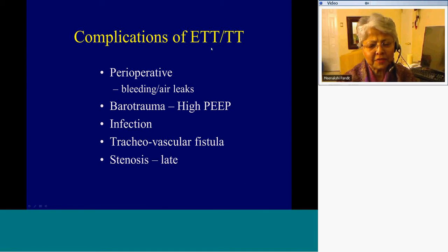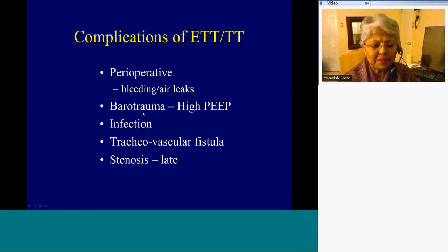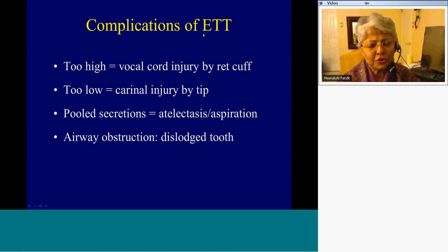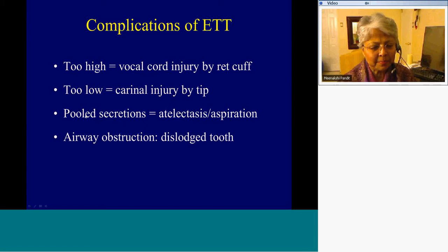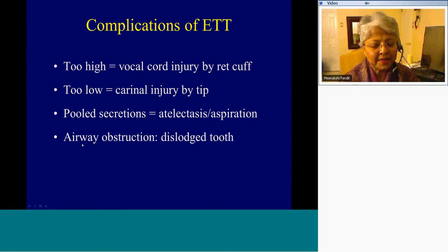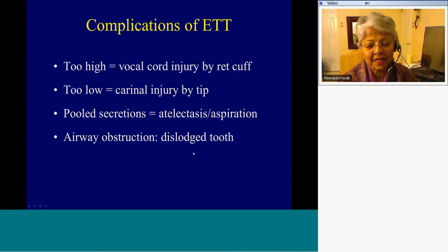What are the complications of intubation to bear in mind? Perioperatively, look for bleeding and air leaks. Subsequently, barotrauma caused by high positive end-expiratory pressures, infections, vascular fistulae, and stenosis as late complications. Endotracheal tubes placed too high will cause vocal cord injury by the retention cuff; if too low, carinal injury by the tip. Pooled secretions above the retention cuff end up in the posterior basal segments of the lower lobes. Airway obstruction can occur if someone places the endotracheal tube aggressively and dislodges a tooth.